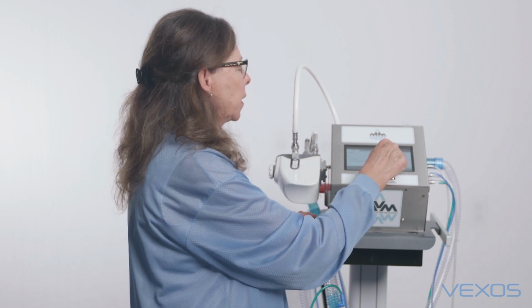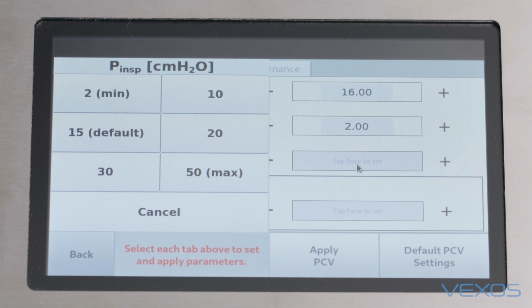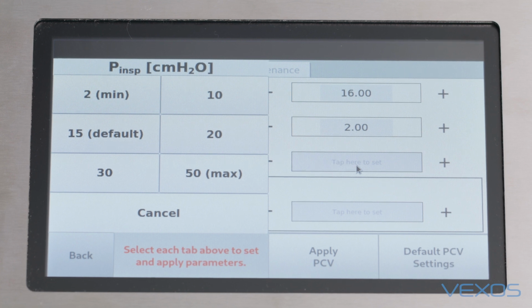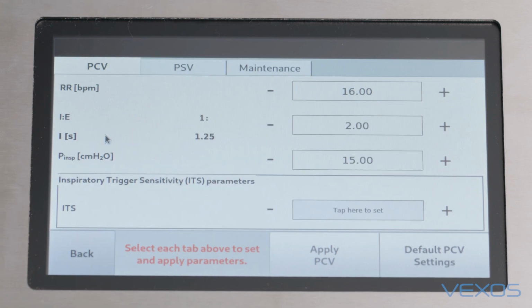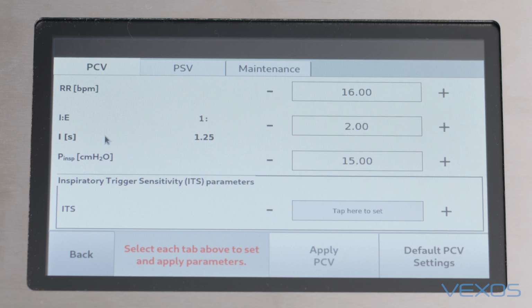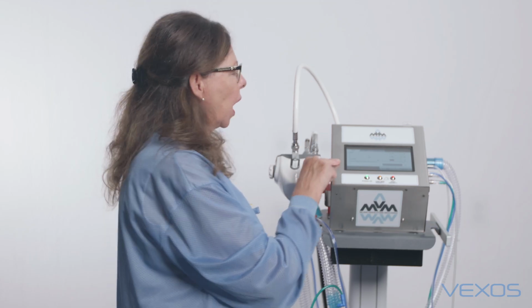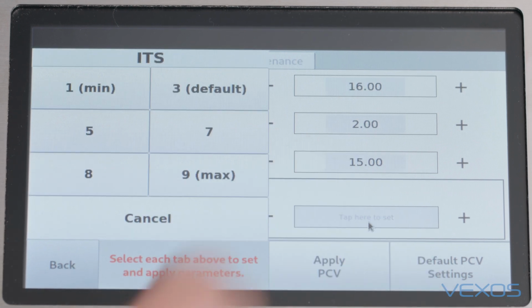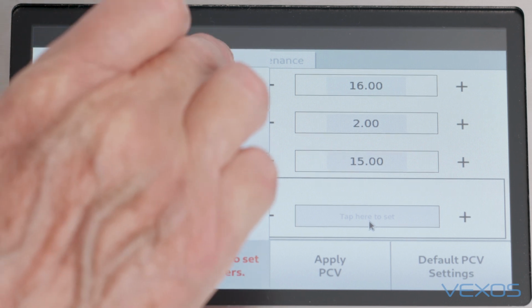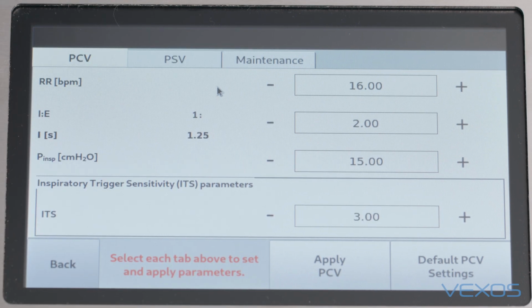The third parameter to set is the inspiratory pressure, P-insp. Again, by tapping here, it provides me with a selection I could use. I'm going to take the default for now, but if I wanted to, I can adjust that by pressing these buttons here. The last parameter to set is the sensitivity, ITS, Inspiratory Trigger Sensitivity. Again, tap here, provides me with a selection of parameters I might want to use. I'm going to choose default, and it's there.